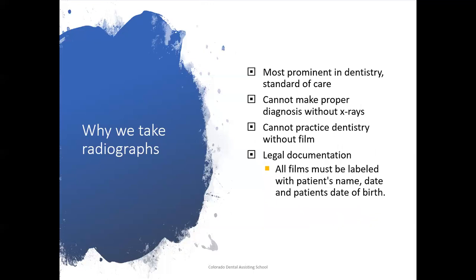There are some symptoms that could lead us down that road, but we really want to make sure that we are giving the best possible care that we can provide. So we cannot make a proper diagnosis without x-rays, and basically we can't practice dentistry without x-rays.